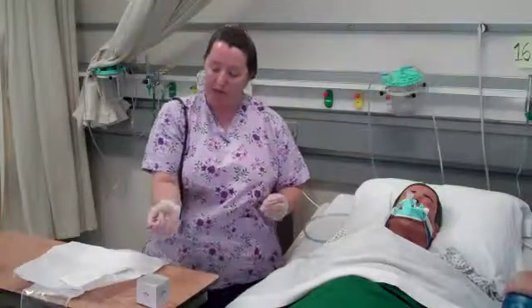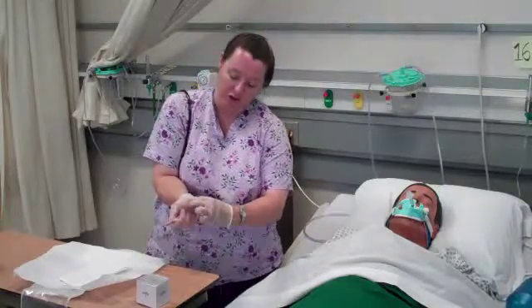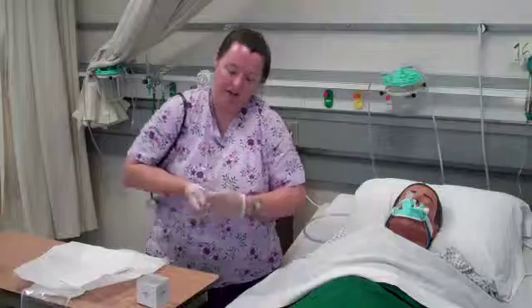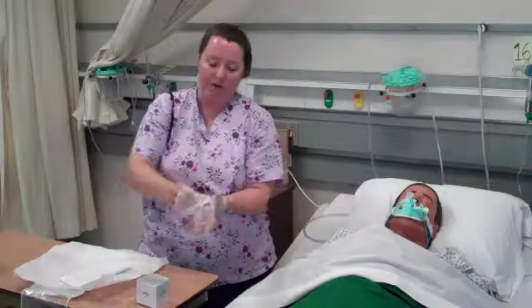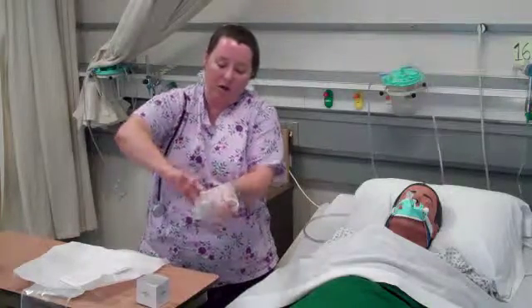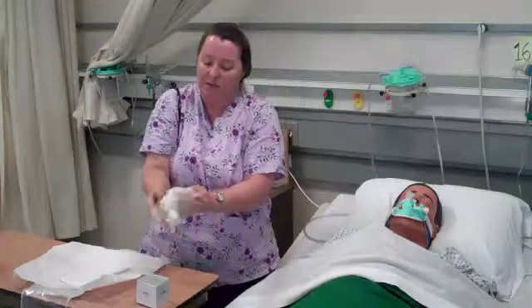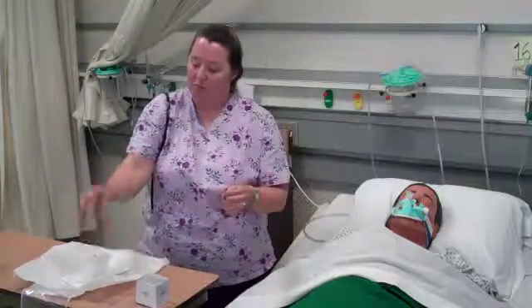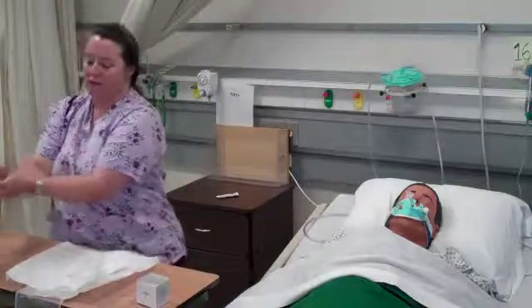And now I'm going to remove my gloves. My tubing is in my dominant hand. I'm going to touch dirty to dirty, so I'm not touching my skin. I'm going to remove the catheter inside of my glove. Now making a mitt inside my hand, I'm going to reach under, pull the gloves over so that I'm not touching any kind of secretions that may contaminate myself. I'm going to put these down, I'm going to throw away my equipment, and I'm going to wash my hands.